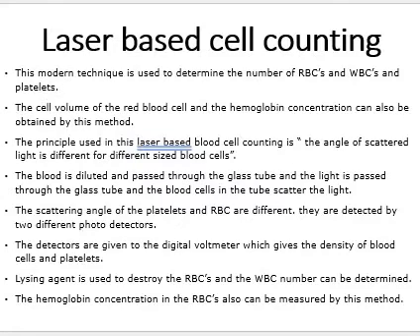Because RBC has a definite size and a definite shape. WBC can also be accounted, but it is not in a definite shape. Platelets are small in size compared to RBC and WBC, and they also have a definite shape.